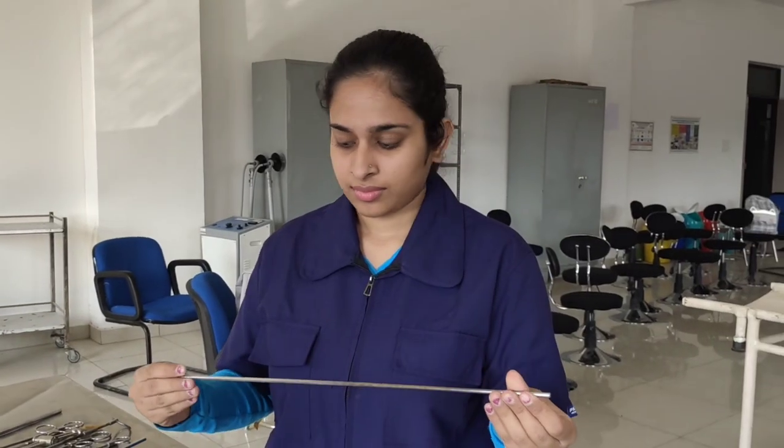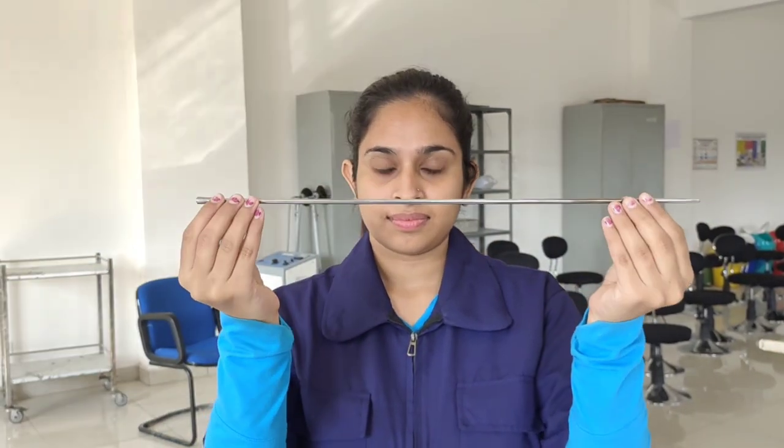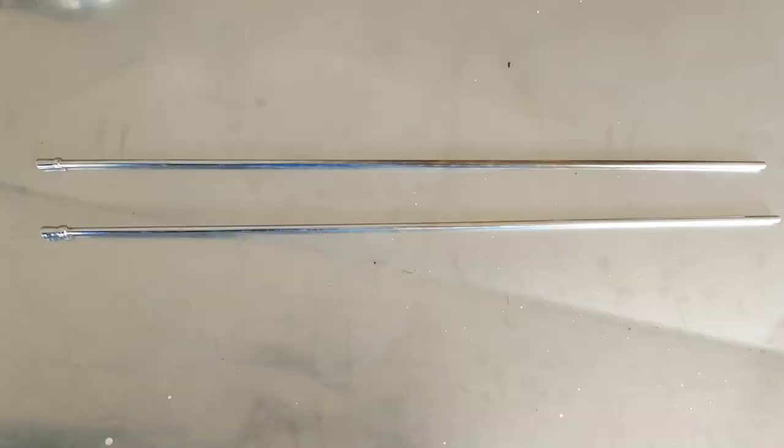The next instrument is this simple metal uterine catheter, used for uterine infusions. The only disadvantage is the single opening at the end. If the animal is in heat or there is excessive mucus in the reproductive tract, when we insert the catheter the mucus may get sucked in.